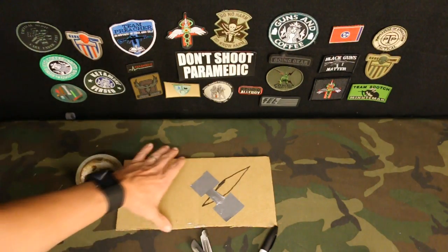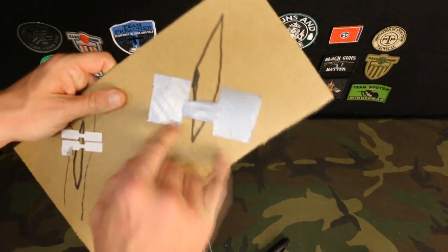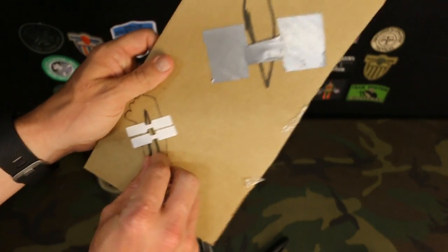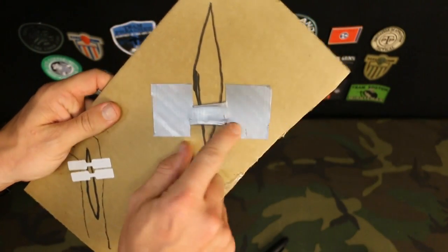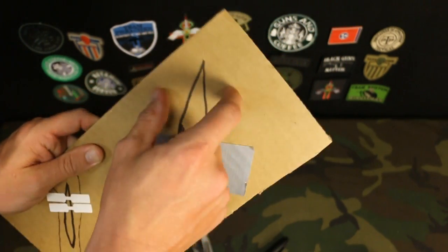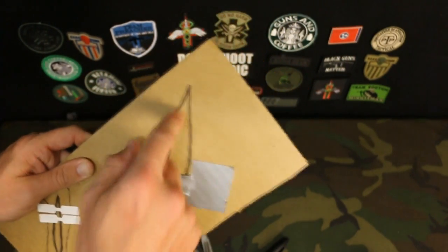Now I made it really dramatic, obviously, but we can make these a lot smaller. You can make these as small as these if you really wanted to. But I made it dramatic just because we're trying to show it on video. But you can make your own butterflies, however big, however small, by just running them on the duct tape.